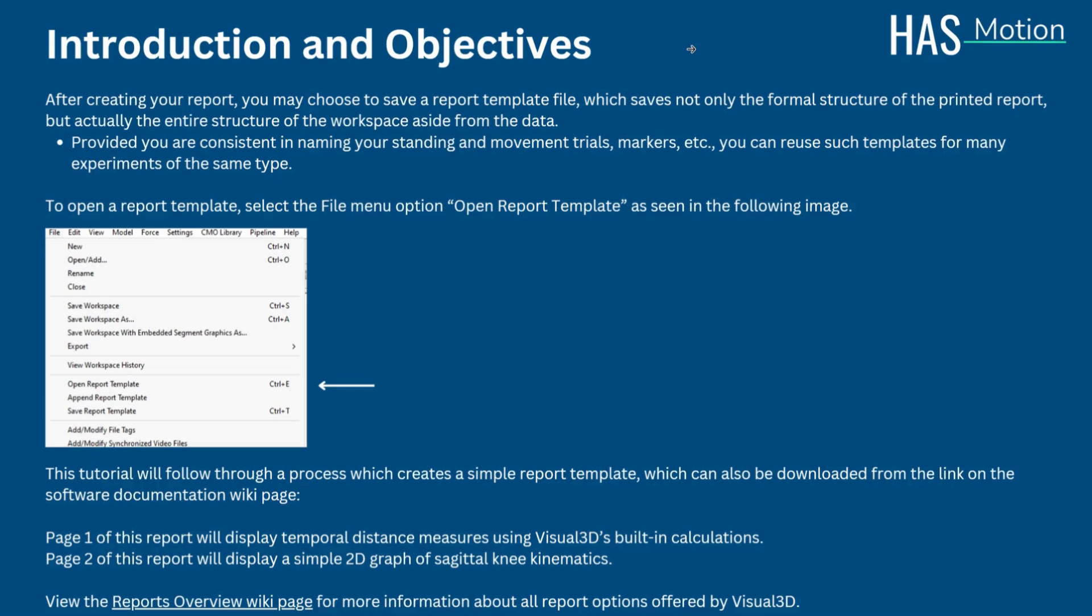This tutorial will follow through a process which creates a simple report template, which can also be downloaded from the link on the software documentation wiki page. Page 1 of this report will display the temporal distance measures using Visual 3D's built-in calculations, and page 2 of this report will display a simple 2D graph of sagittal knee kinematics. For more information about all report options offered by Visual 3D, for example images, text/metric tables, and subject information, please view the reports overview wiki page.